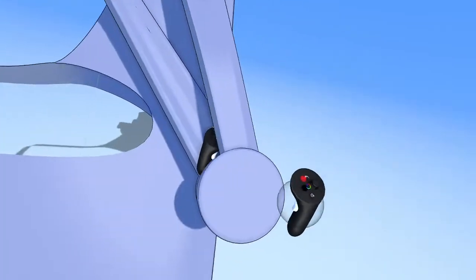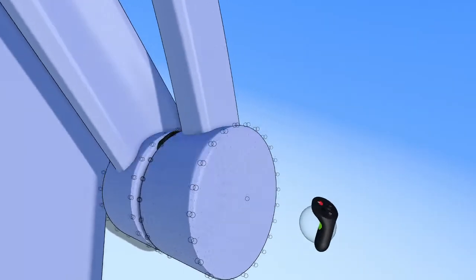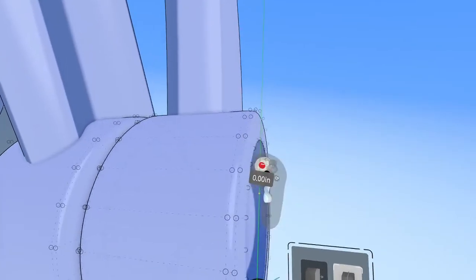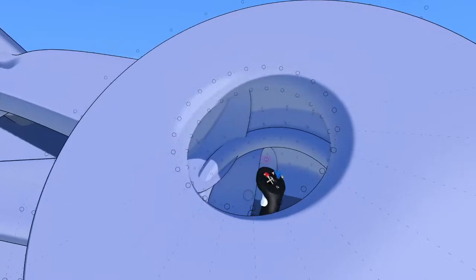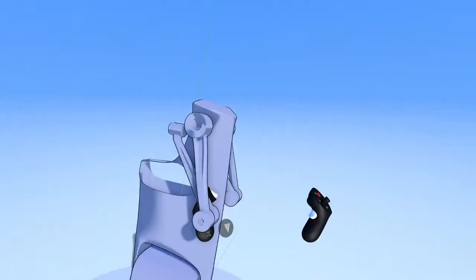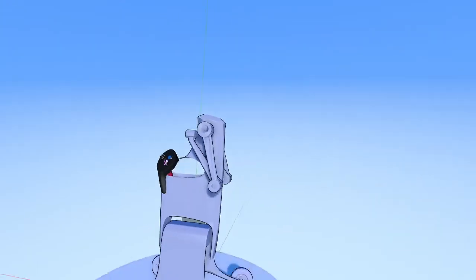And so basically, one thing you'll notice here is with the cylinder, on the cap of the cylinder, all these points converge to a single point right here, and it doesn't look that great when you subdivide it, so usually I delete that and then shrink something in like this. Okay, cool. Elbow's done. And we'll worry about the bit in a little bit.